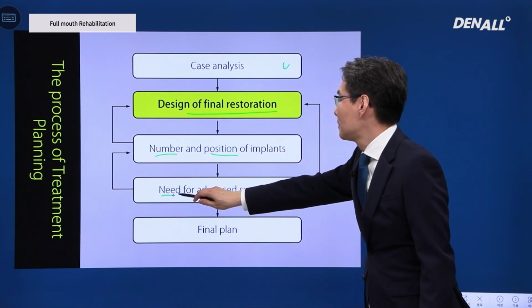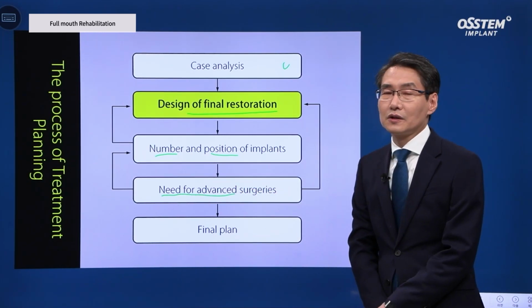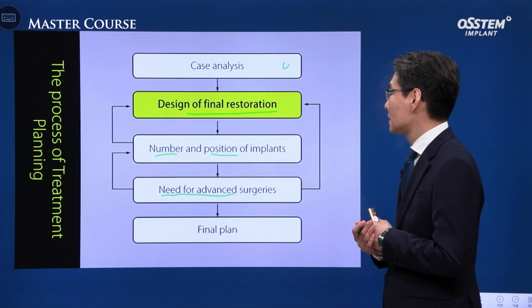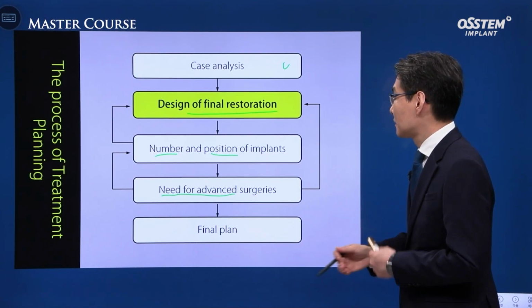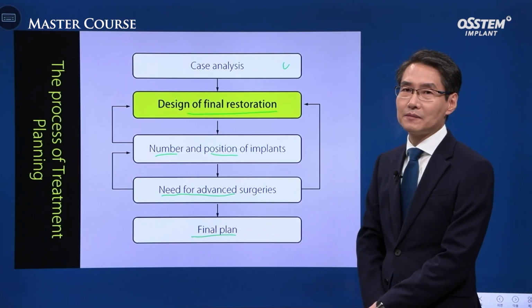In order to place the implant in the planned position, you need to determine whether conventional implant surgery itself is enough or whether it requires a sinus lift or bone graft and other advanced surgeries. After that, the treatment plan is finalized.